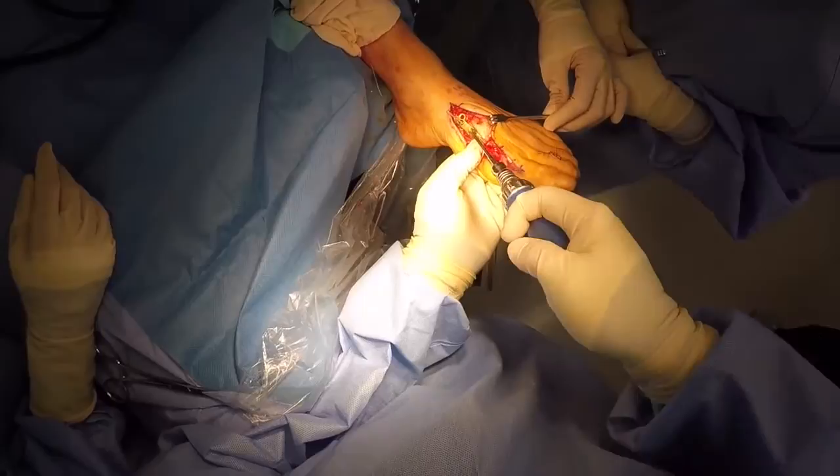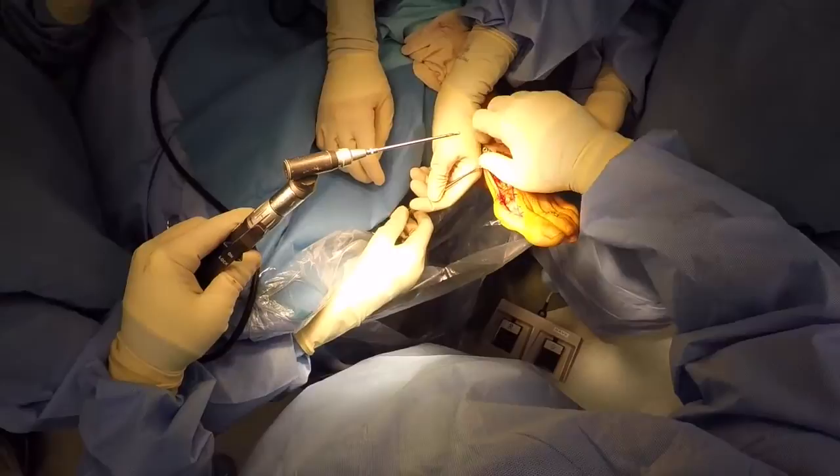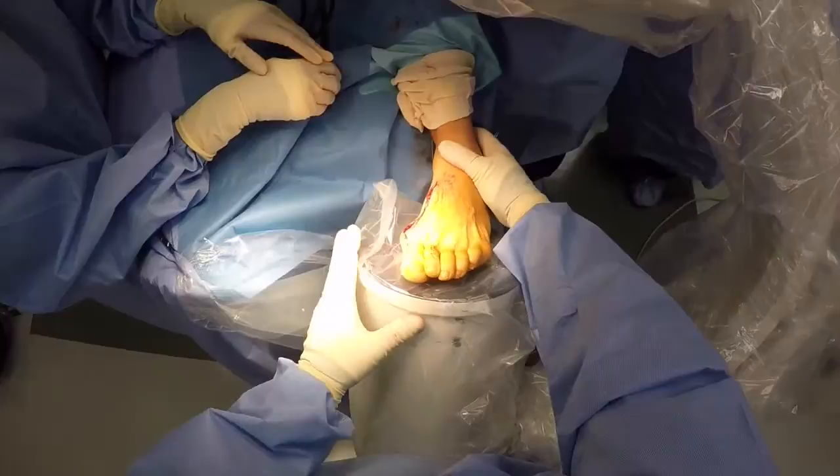We then throw proximal locking screws into the medial cuneiform, utilizing the coaxial guide again for our 3-5 screws. Once all the plate holes are filled with screws, we again visually inspect under C-arm to ensure that our reduction is adequate. So good IM correction.